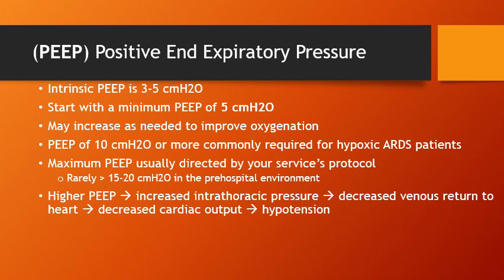Now, the maximum PEEP that you're allowed to set is usually directed by your service's protocol. You're rarely going to use PEEPs of greater than 15 to 20 centimeters of water in the pre-hospital environment. So you may see higher PEEPs than this in the hospital, but likely you're not going to be using PEEPs higher than 15 to 20 outside of the hospital.